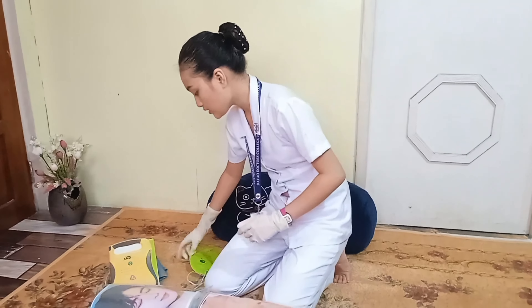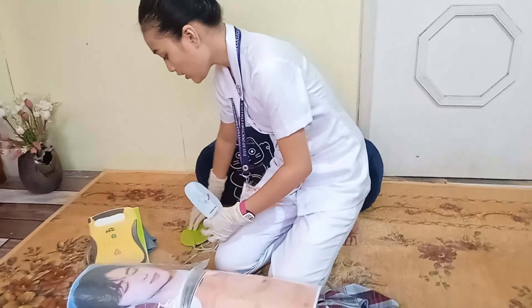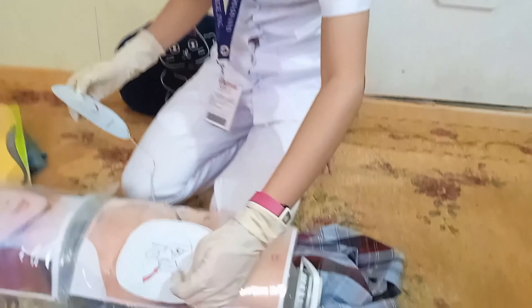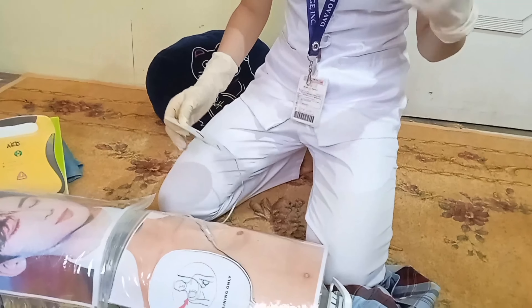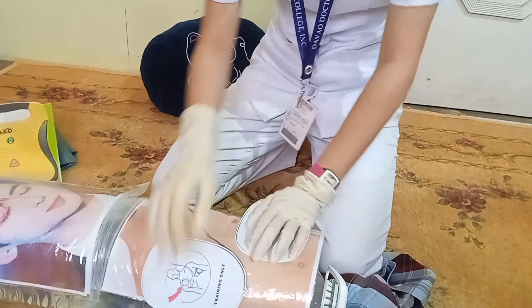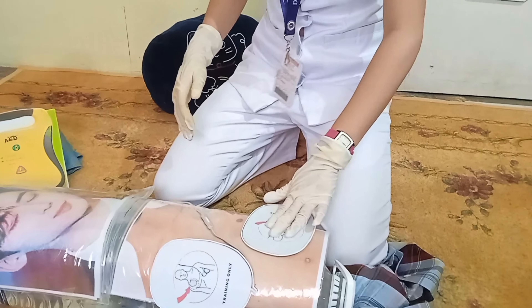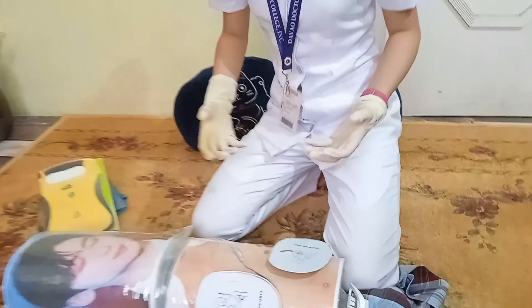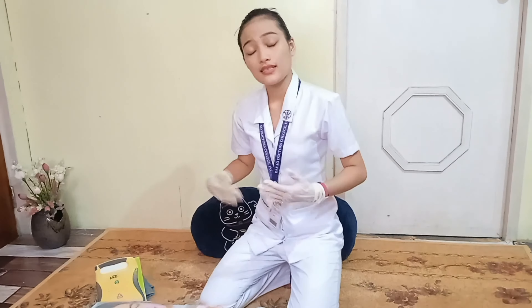Now I am going to place the pads. One will go over the upper right area of the chest just below the clavicle, and the other will be placed beneath the patient's armpit just below the nipple line. Once the patches are placed, the AED will start analyzing the heart's rhythm and may tell us to stop doing compressions and rescue breaths while it is analyzing.